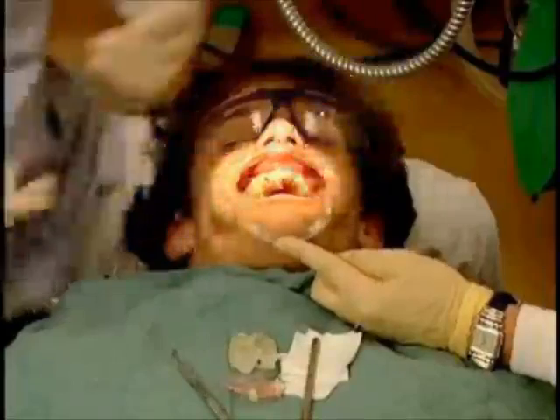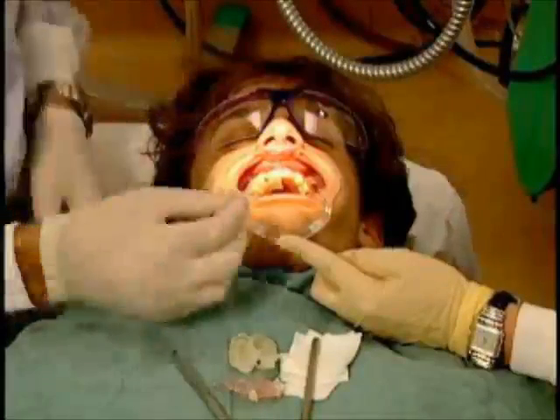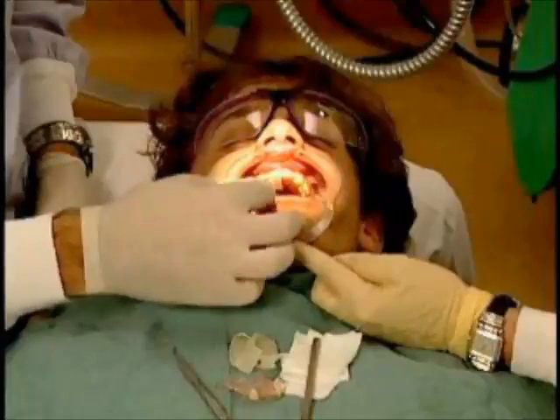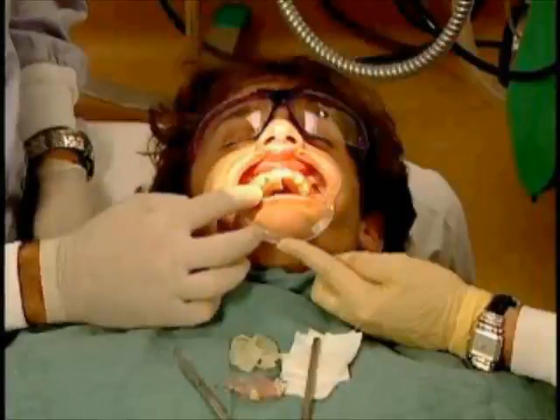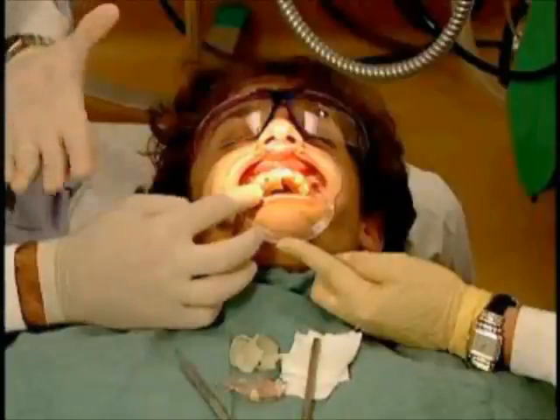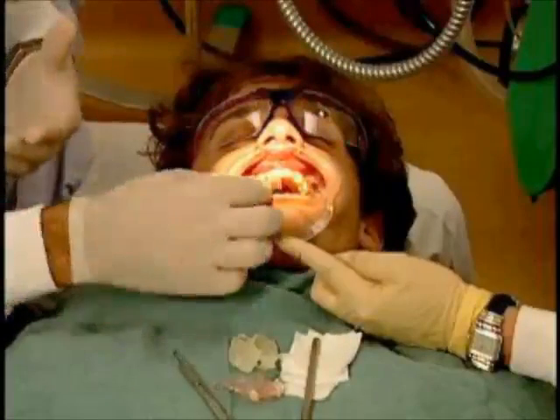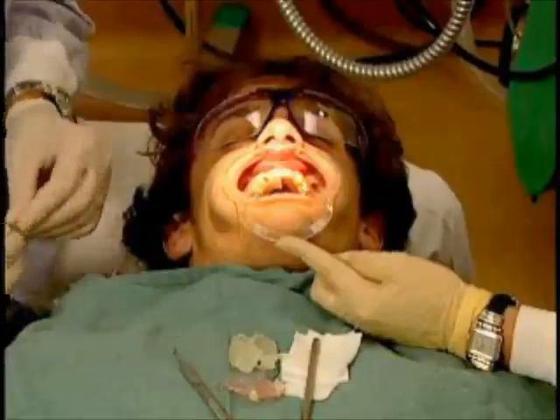This would be more like a 3 millimeter. We can see that we can only angle in the position that was given to us by the preoperative diagnosis. This leads us to the appropriate angulation of the implant placed along certain guides and gives us so much more information than simply placing it through a surgical stent.